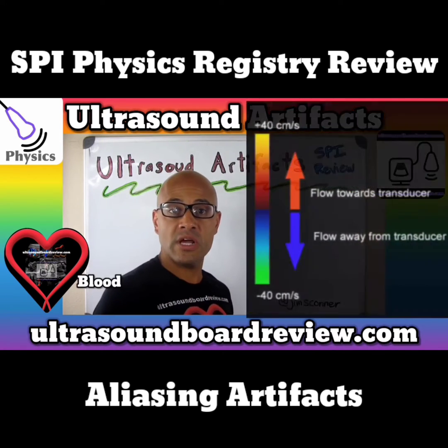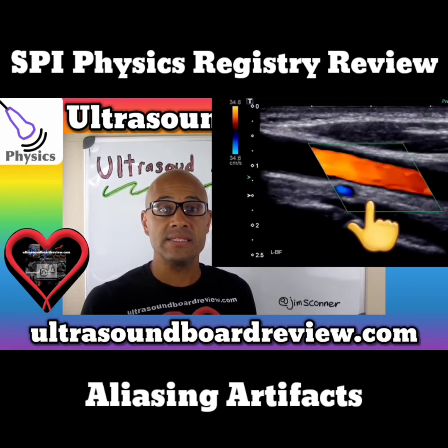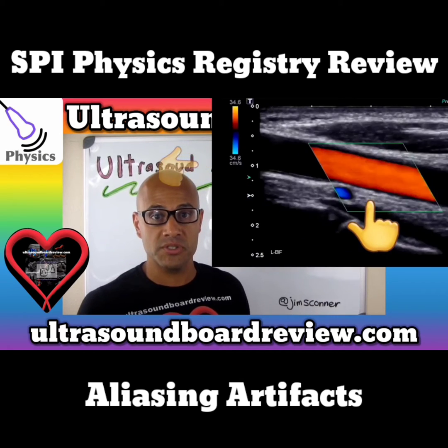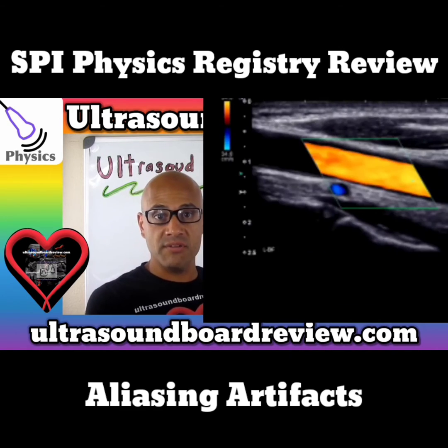Now, coming back to the ultrasound world, this color bar scale lets us sonographers know the limit at which we can detect velocities. Let's say that the blood flow you're looking at is 60 centimeters per second, but your color bar scale is only set at 30 centimeters per second. Every velocity above 30 will be displayed on your Doppler as a bright, turbulent, high velocity flow.